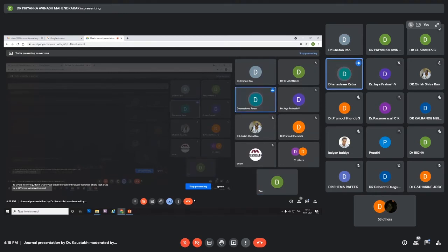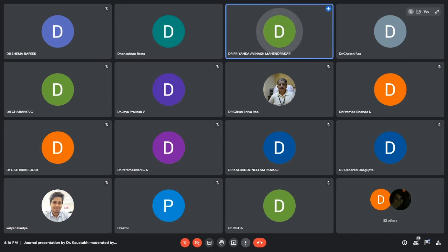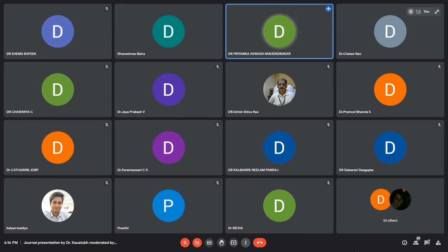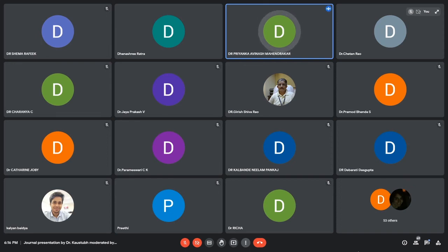Priyanka, this is an interesting take on autofluorescence. Can you just tell us in which patients of RD would you be likely doing this autofluorescence? Ma'am, we can do it in chronic retinal detachment to see where is the hypo-autofluorescence or the demarcation line to demarcate the extent so that we can explain the prognosis to the patients. In acute cases, most likely we won't do autofluorescence imaging.